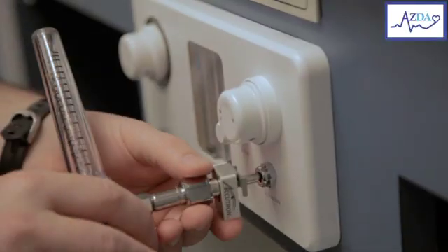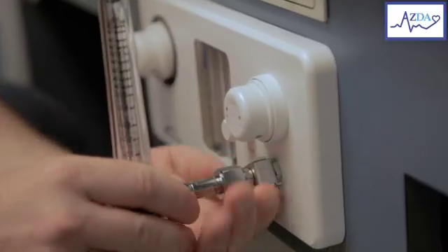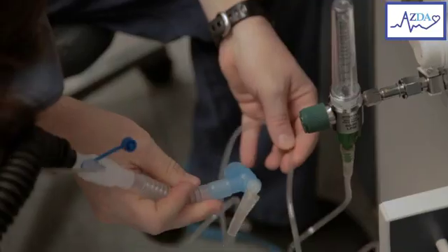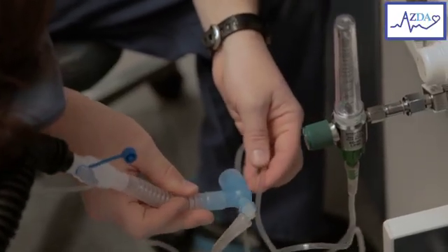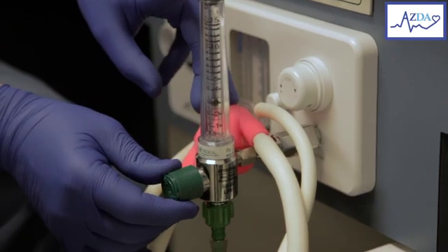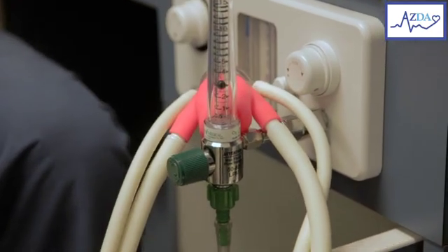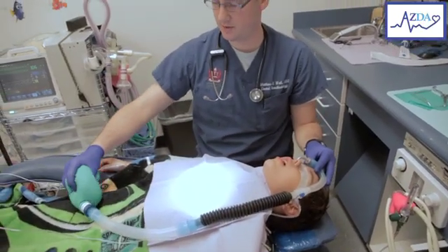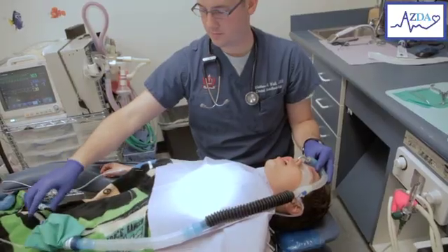The flow meter is hooked up prior to intubating the patient. For the sake of viewers, we inserted this clip so you could see how we are administering oxygen with the Jackson-Rees circuit. There are quite a few different ways to administer oxygen, but from our experience the flow meter is probably the easiest delivery method. The fresh gas flow — which is oxygen — is delivered very close to the nasoendotracheal tube, so re-breathing of carbon dioxide is minimal. We also run our oxygen flow at around 2 to 3 liters per minute.